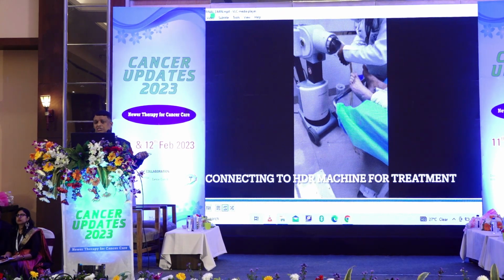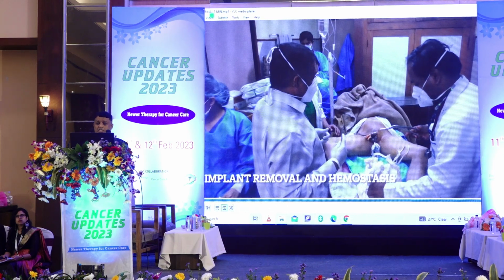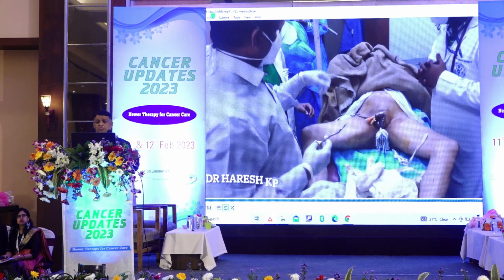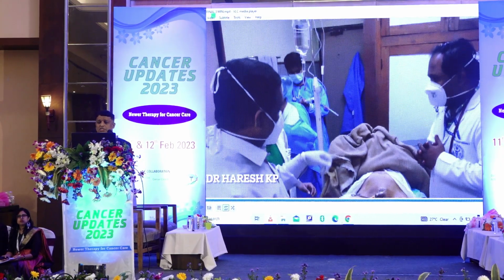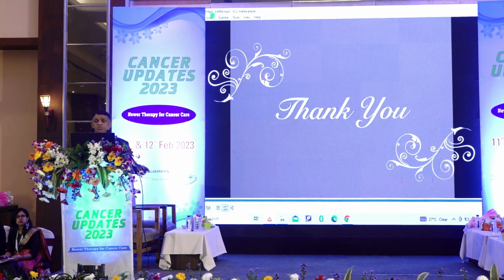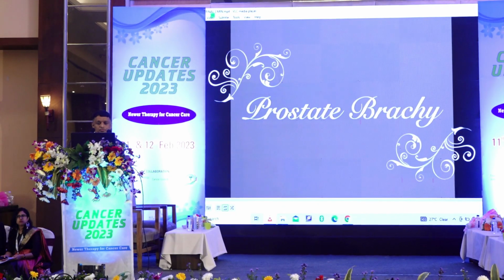The needles are connected to the HDR machine. And we should also be very careful when we remove the implant, following the principles that I already told. And most important, to ensure that the hemostasis is achieved before you send the patient to the ward. Thank you.